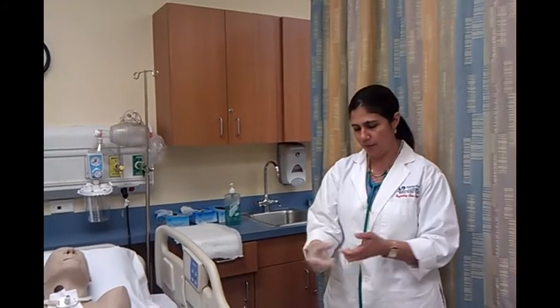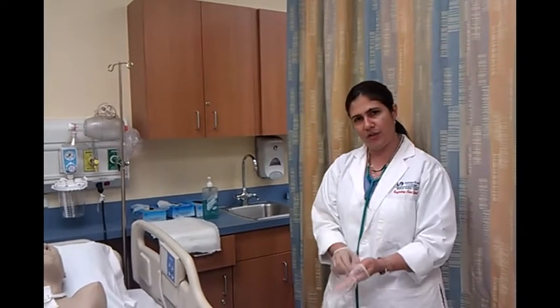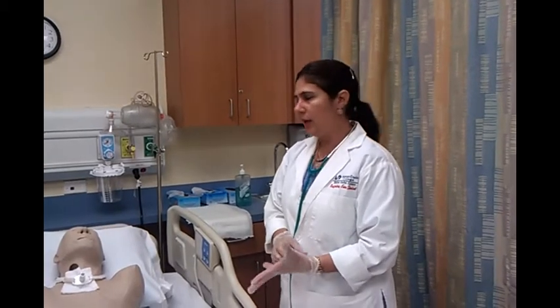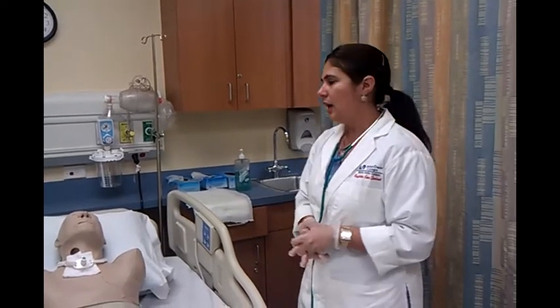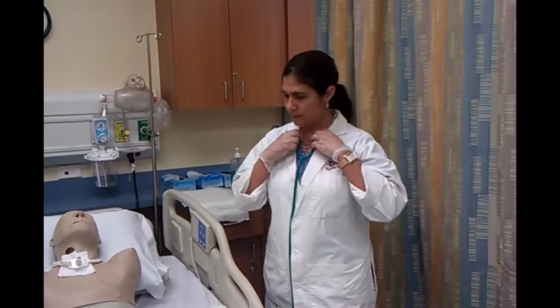After I put my gloves on, I have to identify my patient. I need to ask for his name and his date of birth, and after I see that it's the correct patient, I'm going to do the respiratory assessment. For the respiratory assessment, I have to check the heart rate, respiratory rate, the oximeter, and listen for lung sounds.